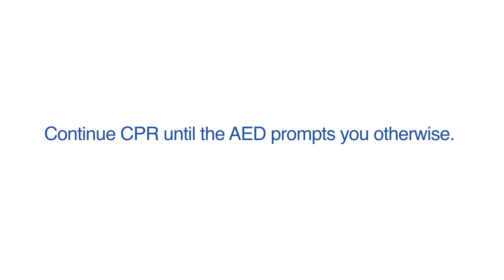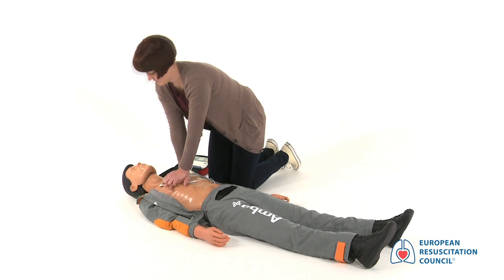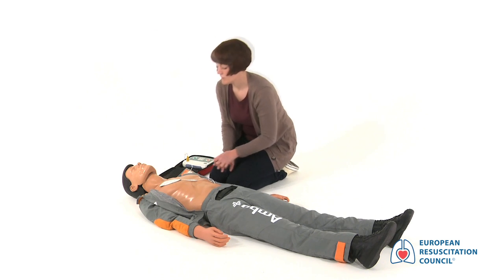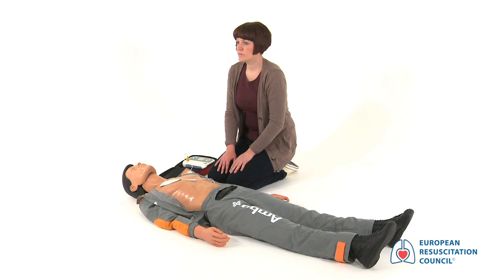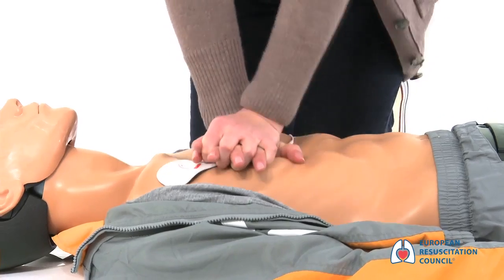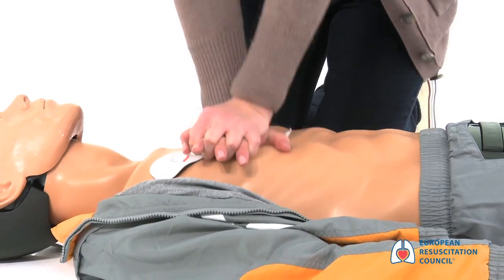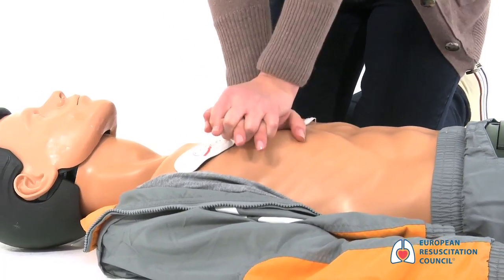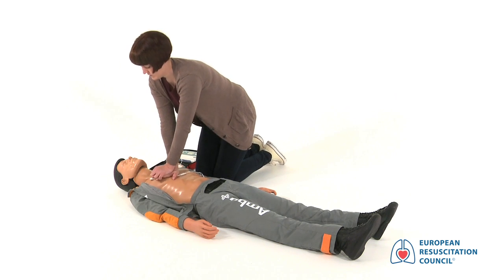When prompted by the AED, stop CPR and look to see that everyone is clear, and call stand clear. Analyzing heart rhythm. Do not touch the patient. Stand clear. No shock advised. If the AED prompts no shock advised, start CPR again as soon as prompted by the AED, continuing until prompted by the AED.